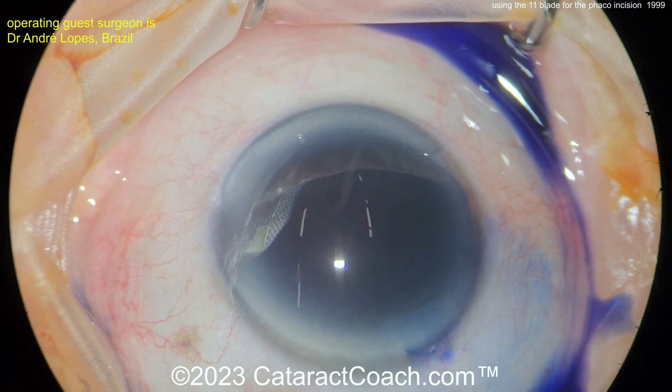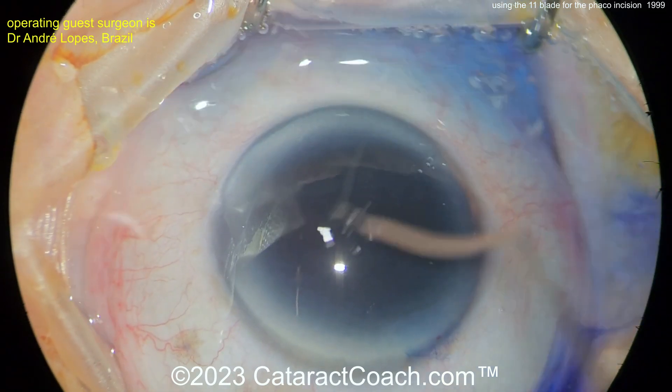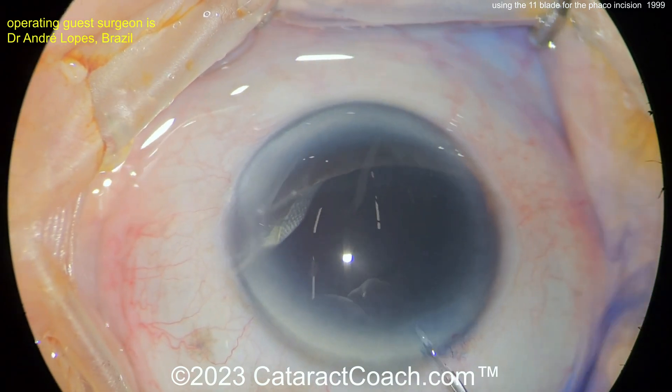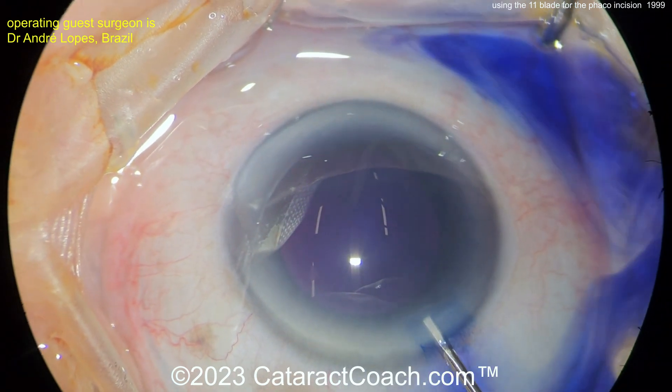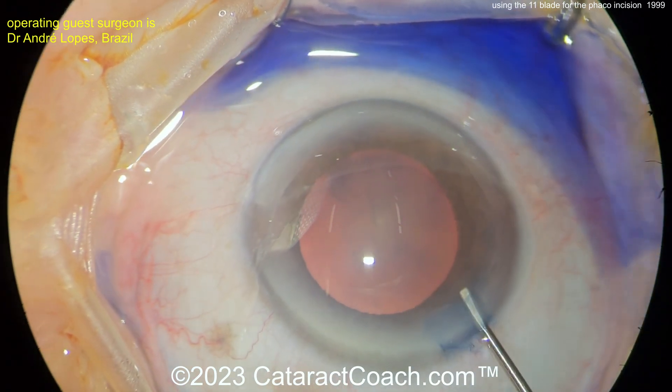If you're not careful, you can inadvertently nick or damage the anterior lens capsule or damage the iris. So if you're an experienced surgeon, you can certainly do this technique. Keep in mind that there are differences in the way people practice — sometimes you'll be in a facility where you don't have access to the most expensive equipment or very expensive keratomes.